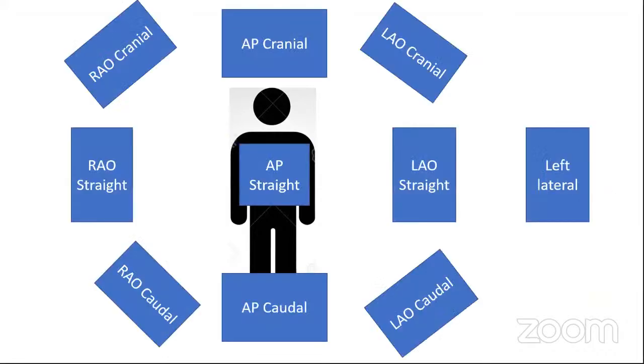So this is our patient on the table. We are looking at him from the ceiling. Just to imagine the views, we have 10 standard views. These are the views, depending on the location of the image intensifier or the camera, as I like to picture it.